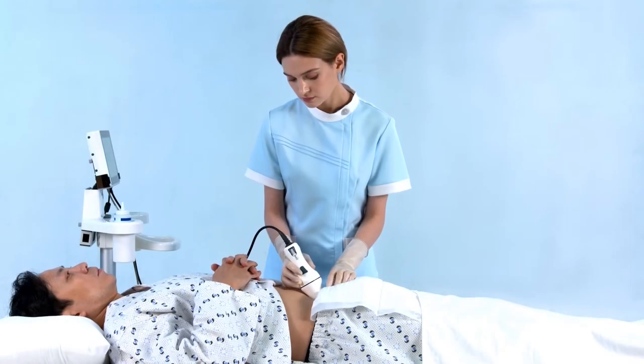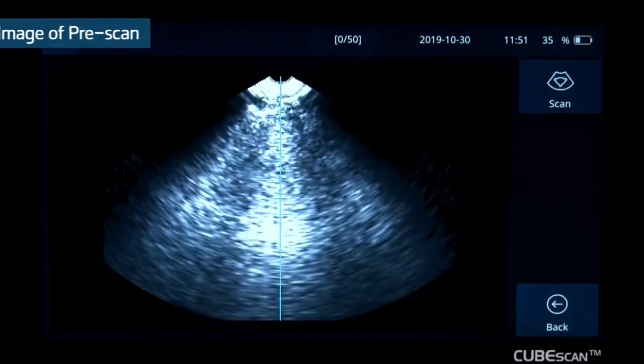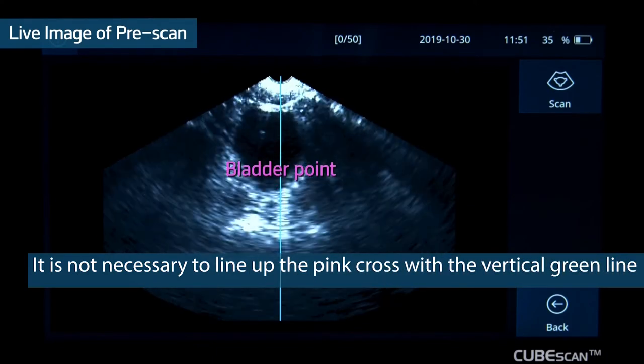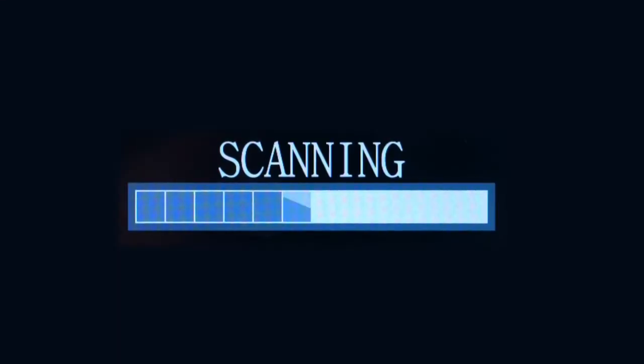Please make sure the probe should be lifted only up to 90 degrees from the abdomen. During the pre-scan, the bladder point and green line will help to get an accurate measurement. Once you have the probe in the optimal position, press the scan button again. Hold the probe steady until the scan is completed.